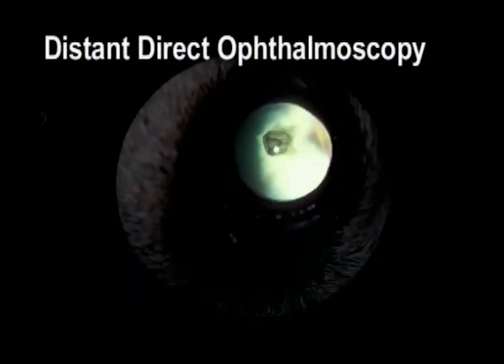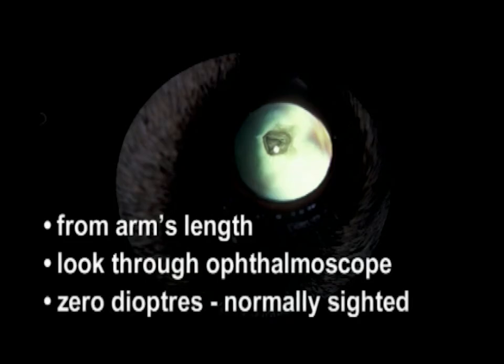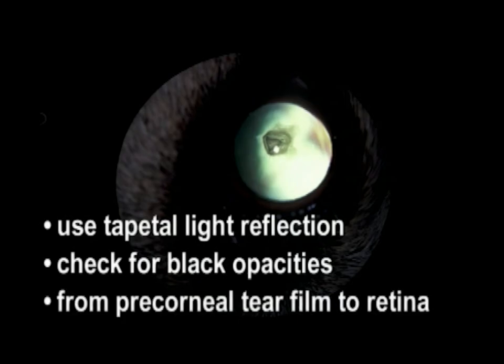The technique requires that from arm's length the observer looks through the ophthalmoscope on a setting of 0 diopters for a normally sighted person. Using the tapetal light reflection, the operator assesses whether there are any black opacities present within the visual axis. These may be located anywhere from the precorneal tear film through to the retina.